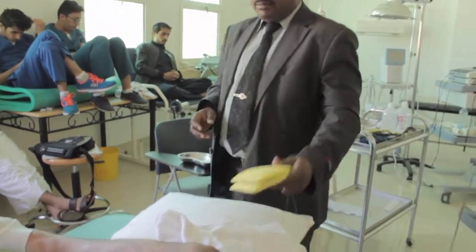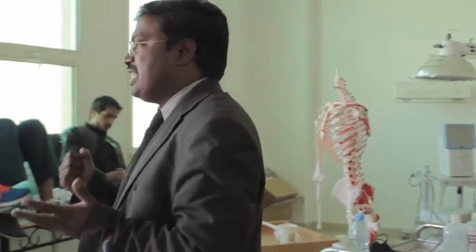So what should be the mode of the current, the intensity of the current, the duration of the stimulation and frequency of stimulation. When you want to strengthen the muscle, the type of the current should be Russian current, that is mode. The mode of the current is Russian currents with 50 pulsed burst frequency, usually in surged mode. That is the mode of the current.